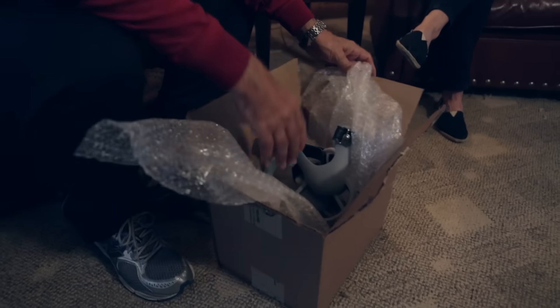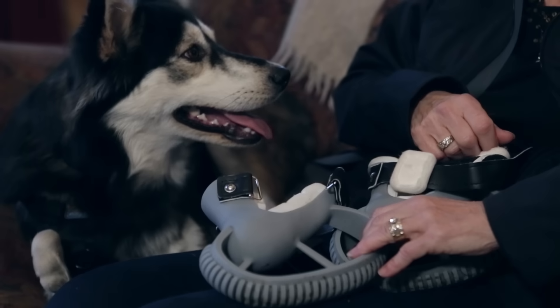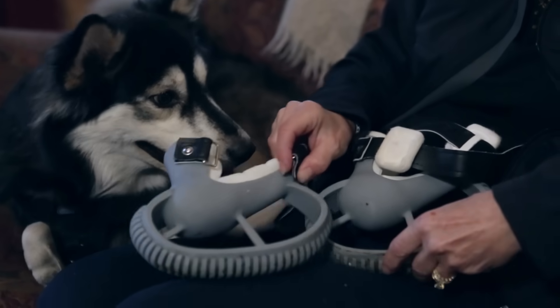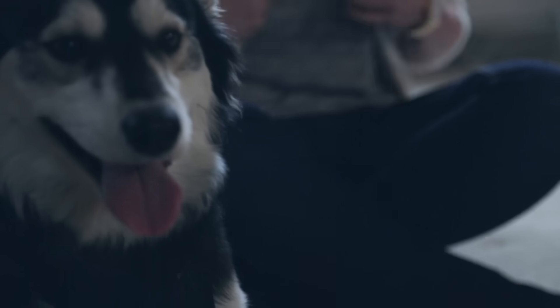Hey Derb, we got your new legs. We started off very low so that it wouldn't be too drastic. We have a line called the Projet 5500 which enables us to run dual materials, and that has really been key with designing his prosthetics.